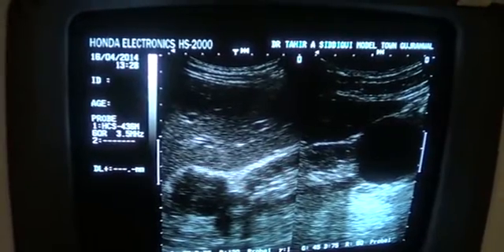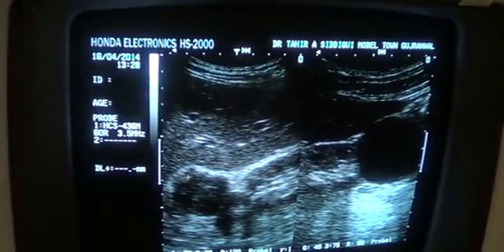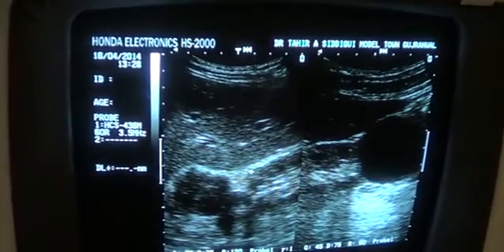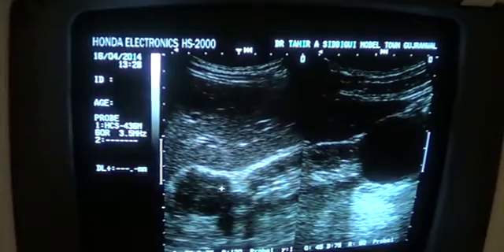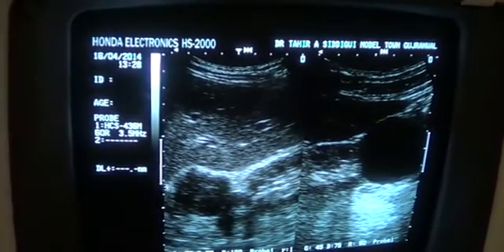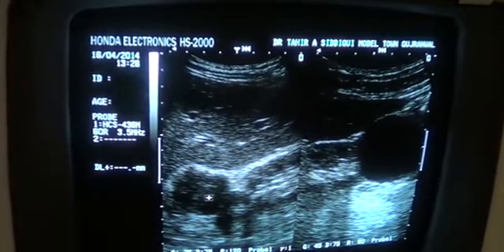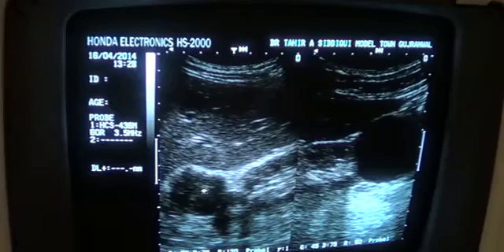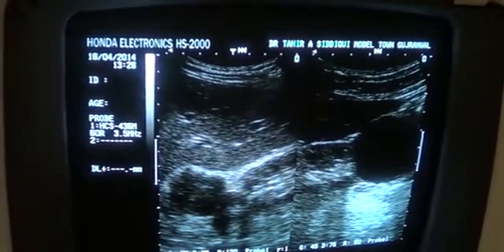Here it is making a kink with the upper pole of the kidney. So this area of study is: number one, well-demarcated; number two, hypoechoic; number three, no calcifications are seen within it, and it is solid.